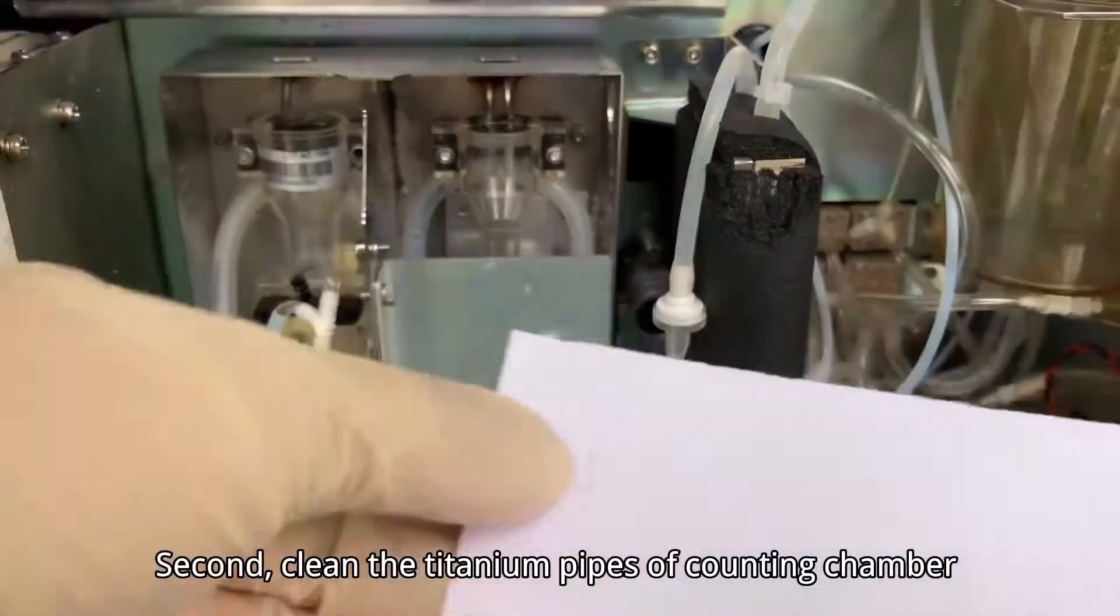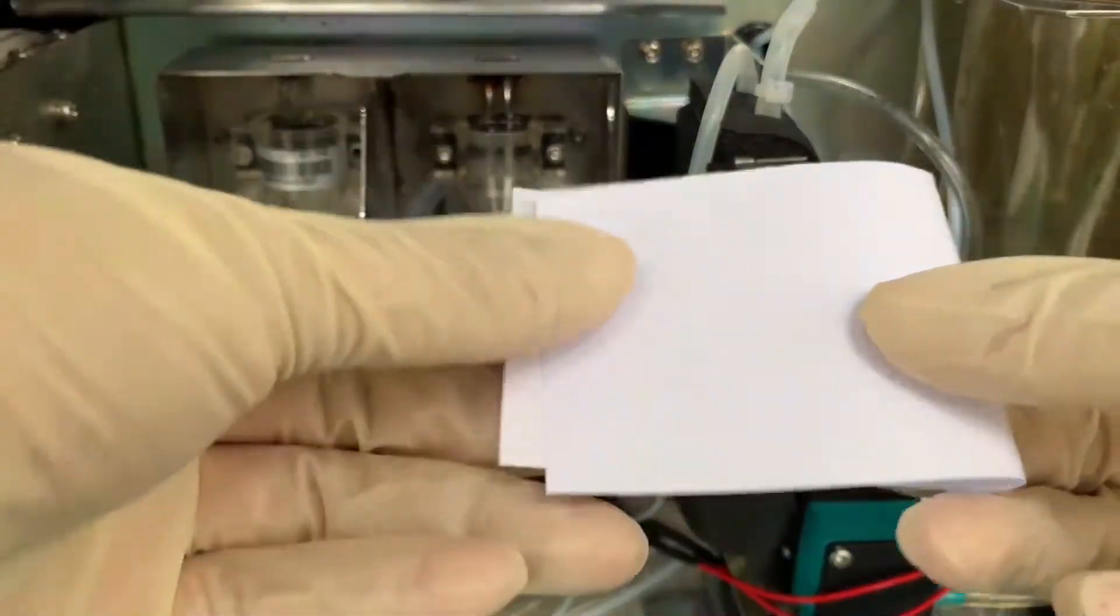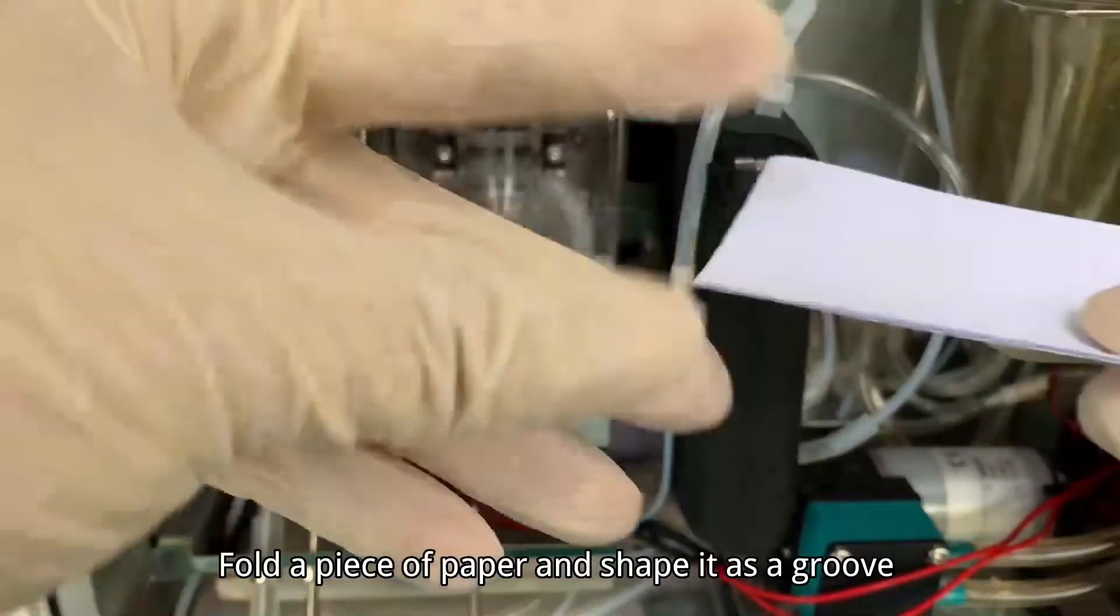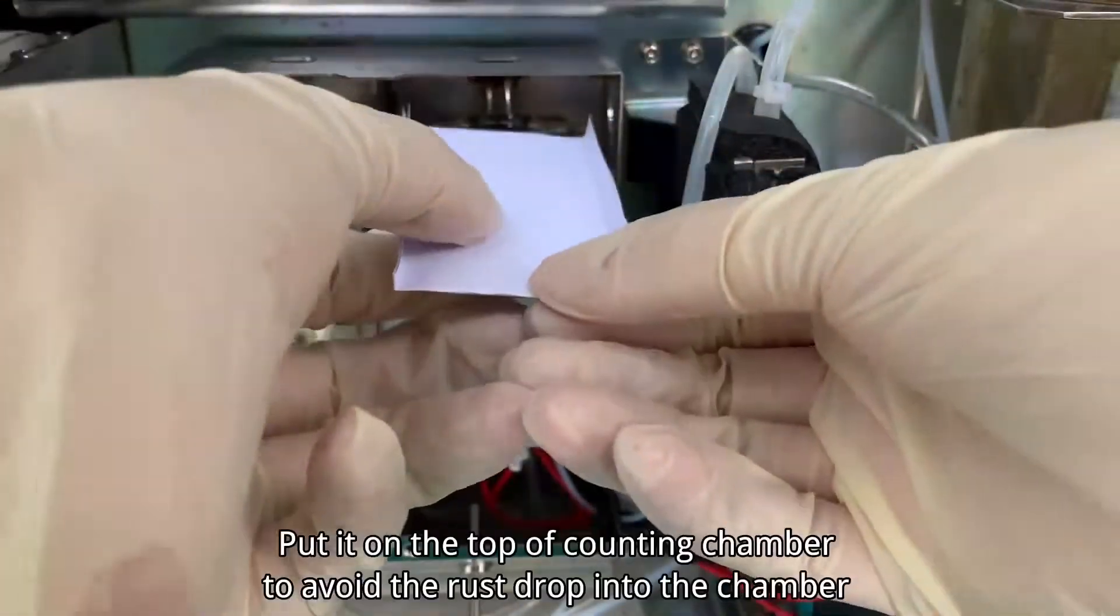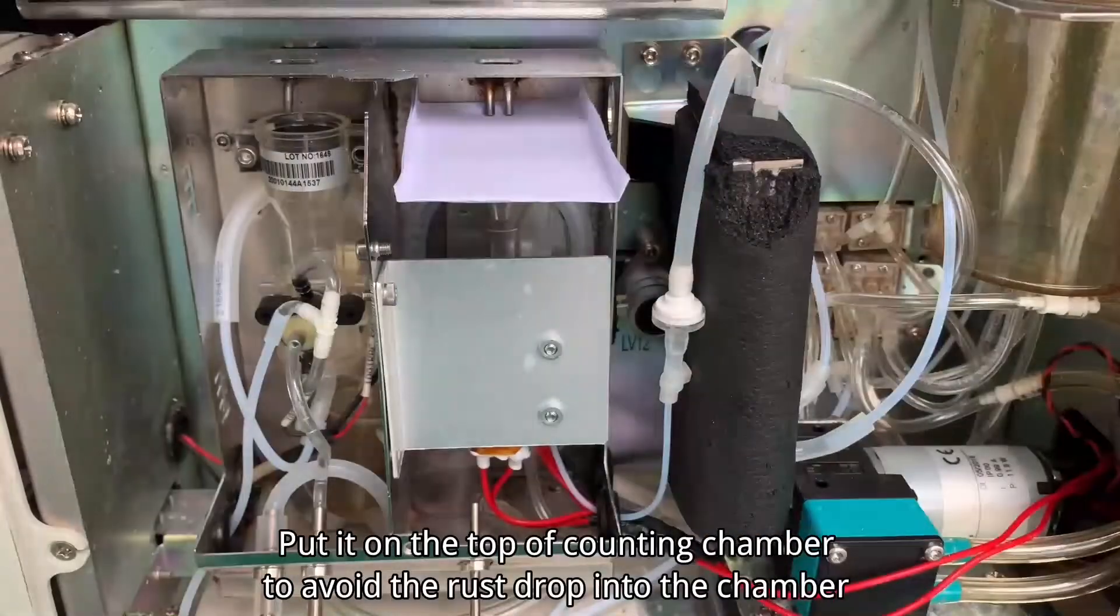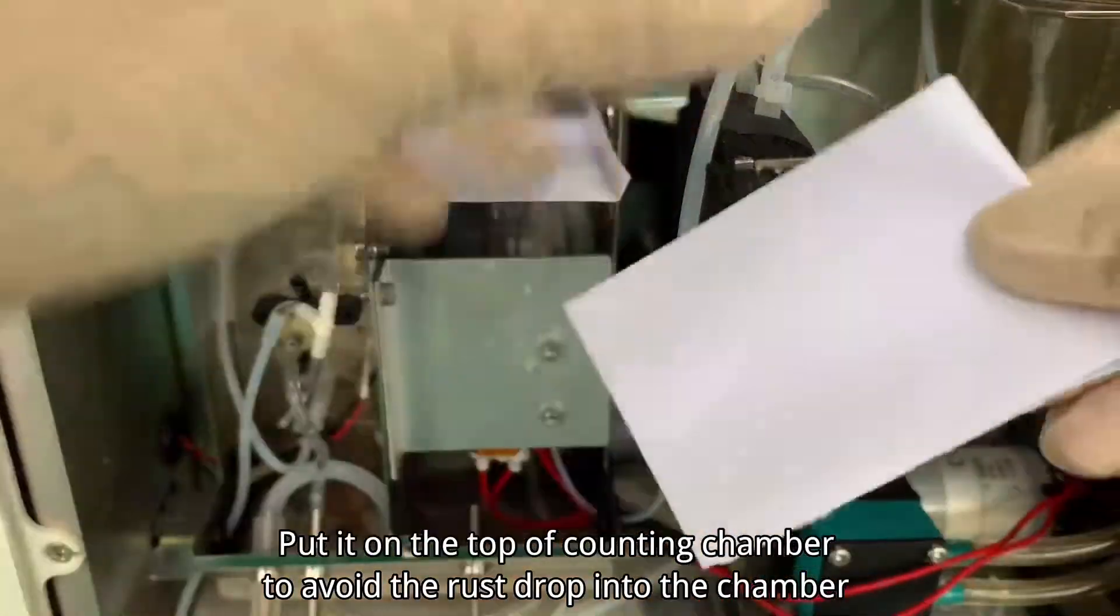Second, clean the titanium pipes of the counting chamber. Fold a piece of paper and shape it as a groove. Put it on the top of the counting chamber to avoid the rust dropping into the chamber.